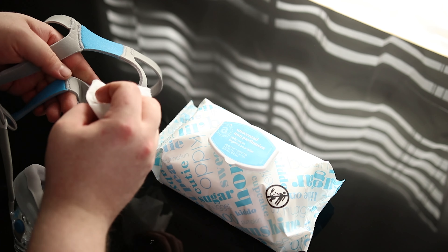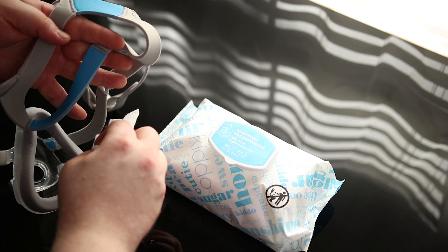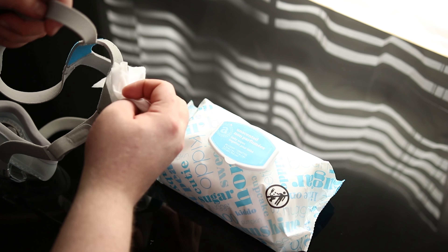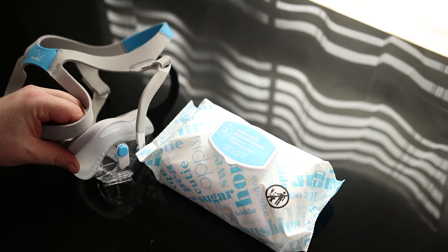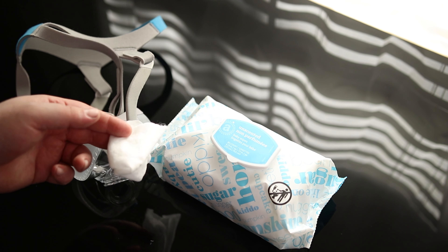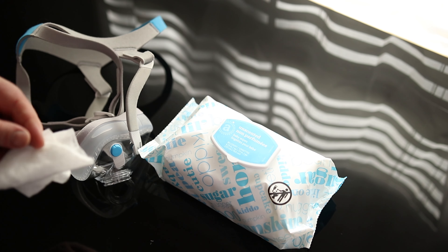You want to make sure that if you're sweating or anything throughout the night, that you're getting that somewhat clean. If you do that once a day, it stays very clean, but you should still just take this whole thing and dunk it in some warm, soapy water once a week. The unscented baby wipes are great to use once a day to make sure everything stays clean so that you don't get sick.